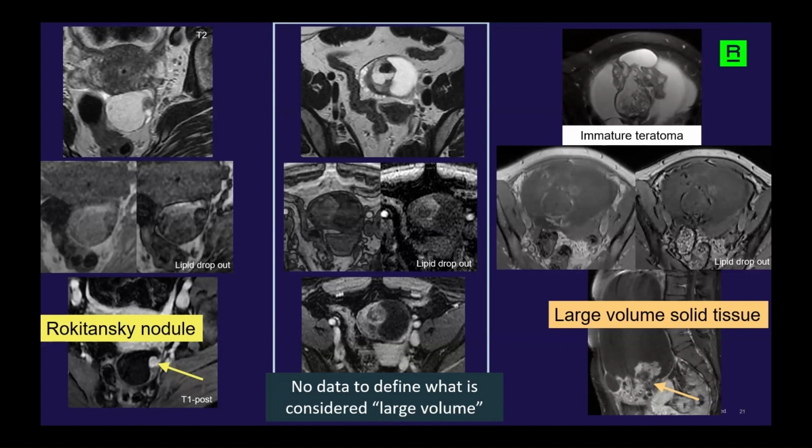And it is, in my opinion, based on your comfort level of seeing these. And in the beginning, when you see these, you may be upgrading some Rokitansky nodules. But I don't think you're going to miss large amounts of tissue. And so let's just talk through what happens if you put this into 4.